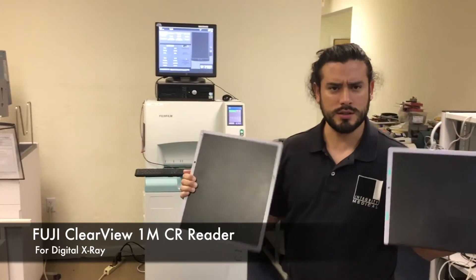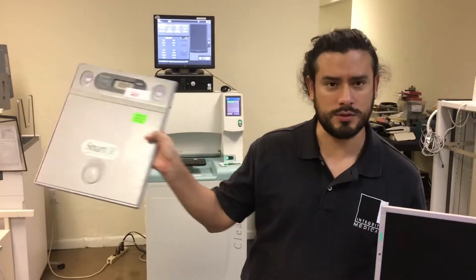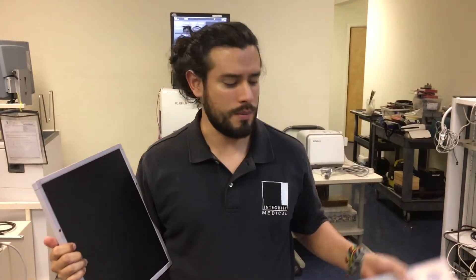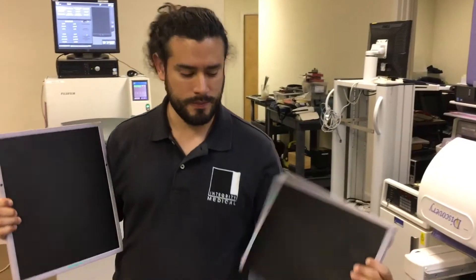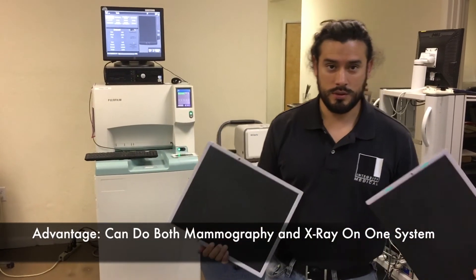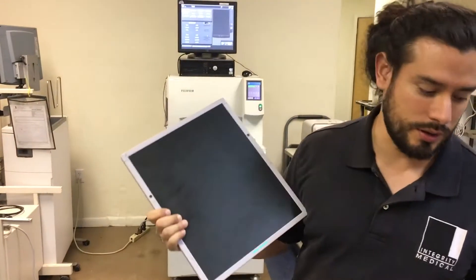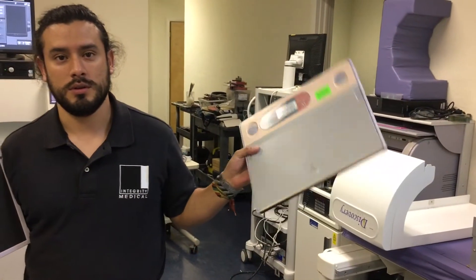We're going to look at these two different cassettes. They might look very similar, but one is for regular x-ray and one is for mammography. The advantage of having this CR reader is that you can do both — mammo and x-ray. It will take a C-type cassette for x-ray and a regular mammo cassette for mammo.